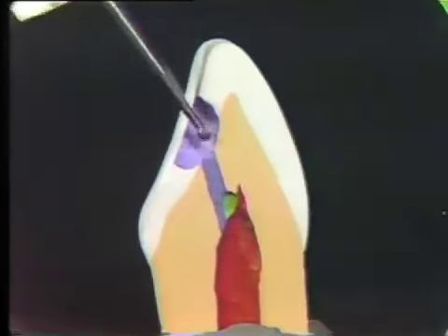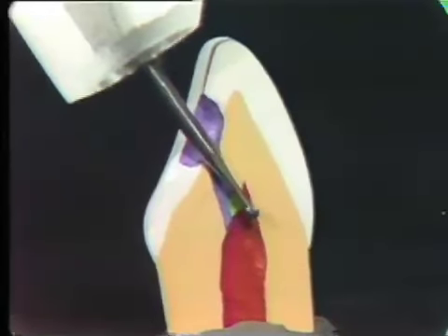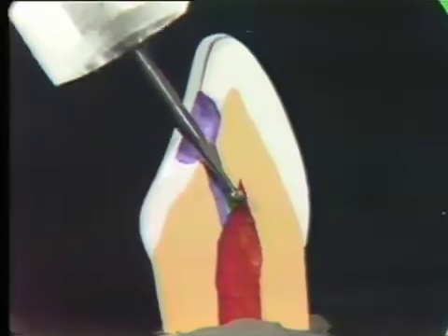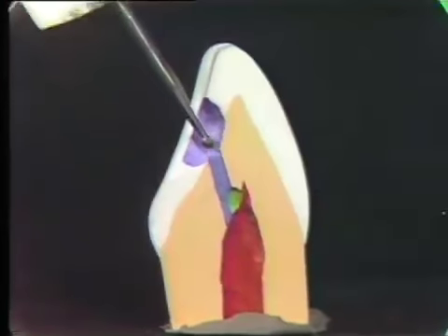Okay, returning the burr into the pulp chamber, feeling for the wall, keeping away from the wall, recognizing where the roof of the pulp chamber starts, you slowly remove the roof of the pulp chamber, working from the inside out.